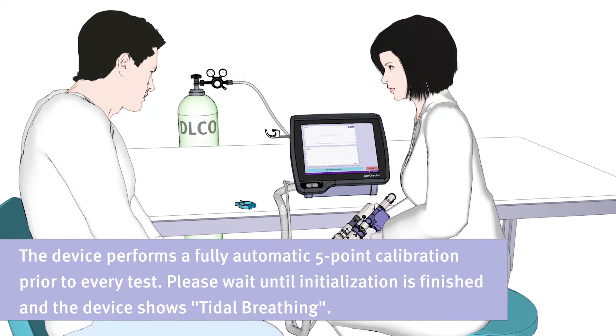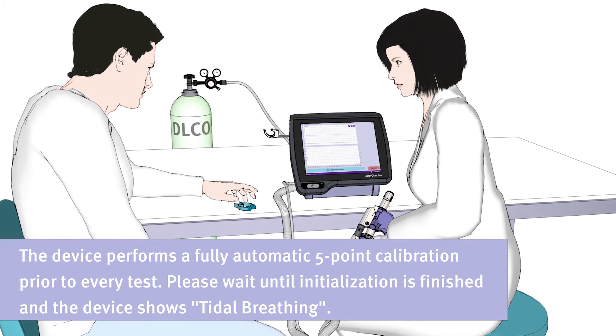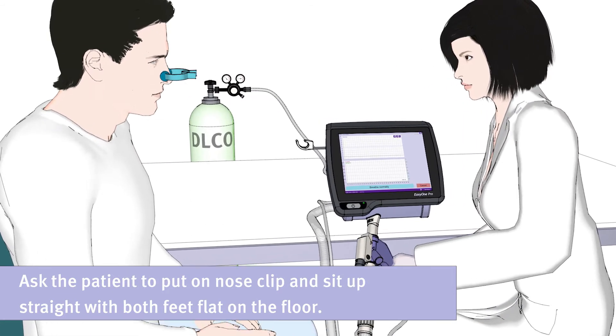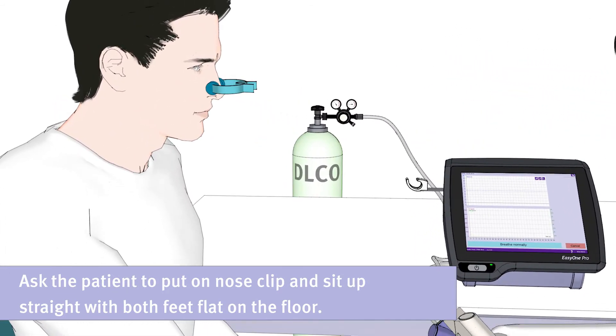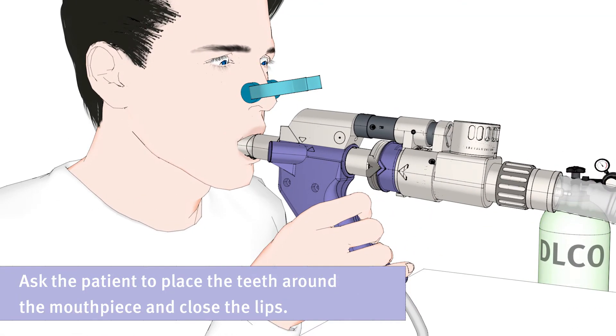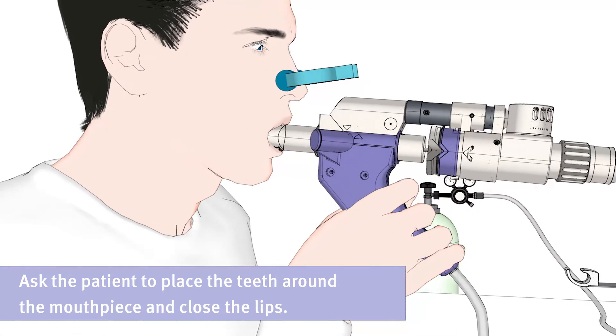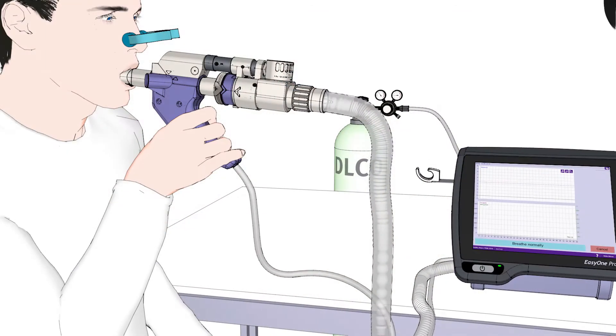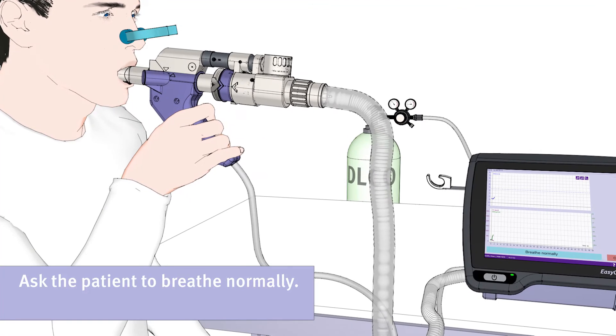Please wait until initialization is finished and the device shows tidal breathing. Then, ask the patient to put on the nose clip and sit up straight with both feet flat on the floor. Now, please ask the patient to place their teeth around the mouthpiece and close their lips. Ask the patient not to bite or block the spirette with his tongue or teeth and to avoid leaks. Ask the patient to breathe normally.